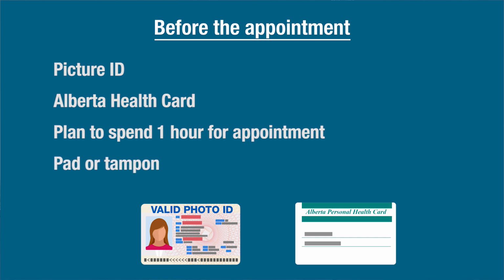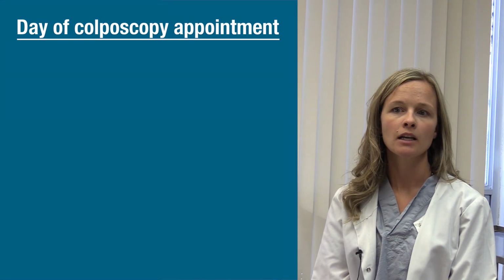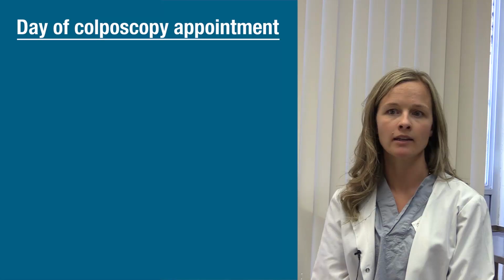It is important that you do not miss any of your appointments. If you are unable to come, please telephone the clinic directly and make sure you get a new appointment date and time. Day of colposcopy exam. Confirm your contact information at check-in.